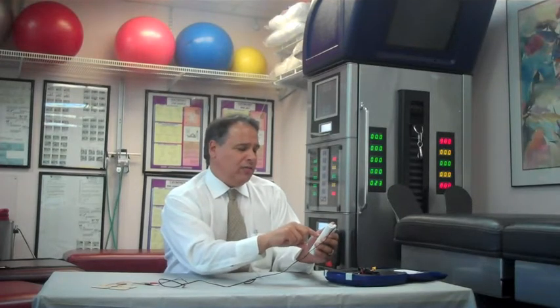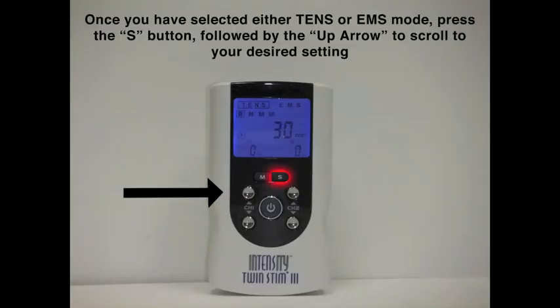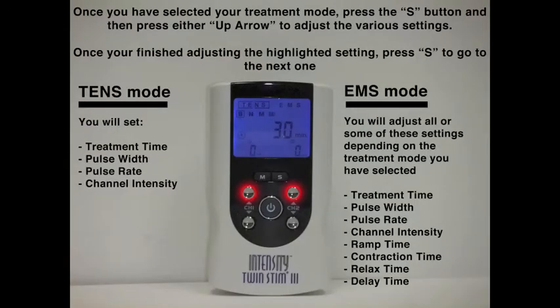Press the S, and then with the up arrow, we will be able to scroll throughout the modes. Select the N, press S again, and you'll be able to change the time. You'll see a clock flashing — use the up and down arrow to set your preset time. Press S once again and PW, or pulse width, will display. Use the up and down arrow to change that parameter.